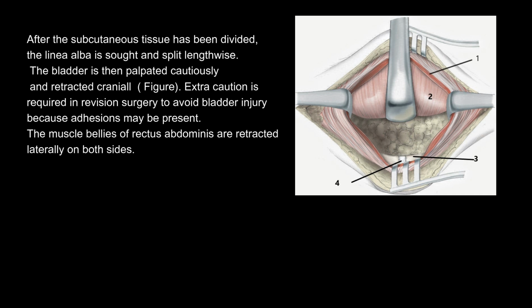Exposure of the symphysis with the bladder retracted cranially. 1. Rectus abdominis. 2. Bladder. 3. Superior pubic ramus. 4. Symphysis.